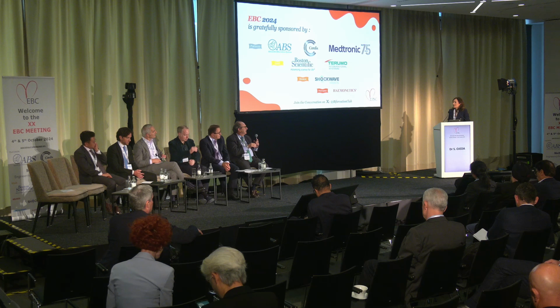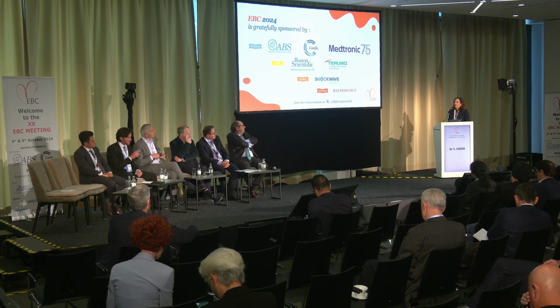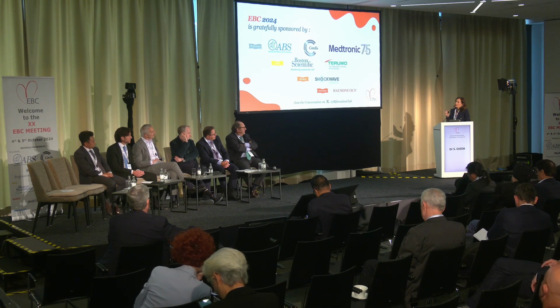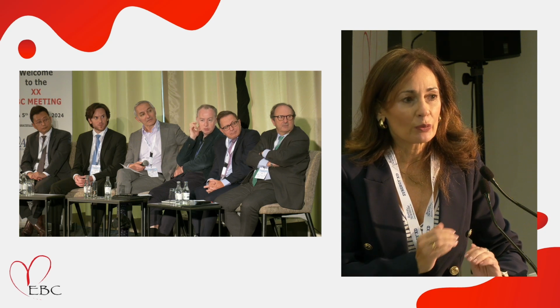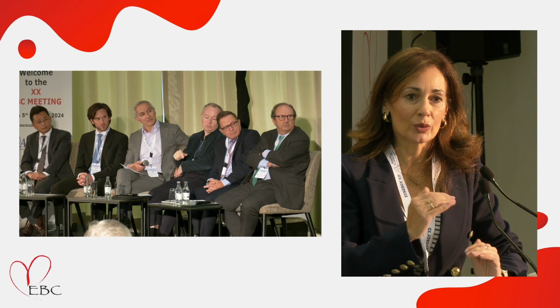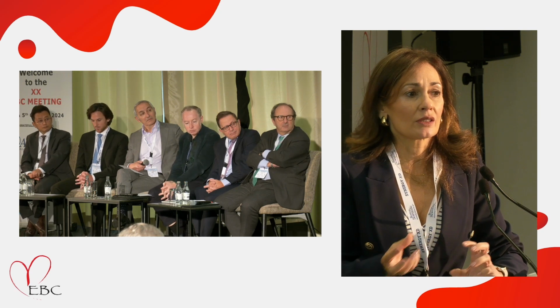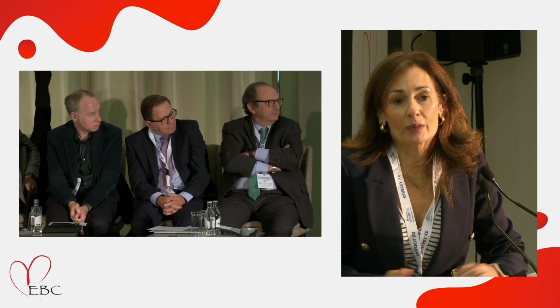I think in some selected patients, nailing the ostium can have a role. For example, when the angle is perfect and the circumflex is not very big or very large. You need to implant at least 3.5 millimeters to make sure in the left main you are going to achieve a good apposition. If the left main is very big and the circumflex is not more than 2.75, and the angle is perfect, probably yes.